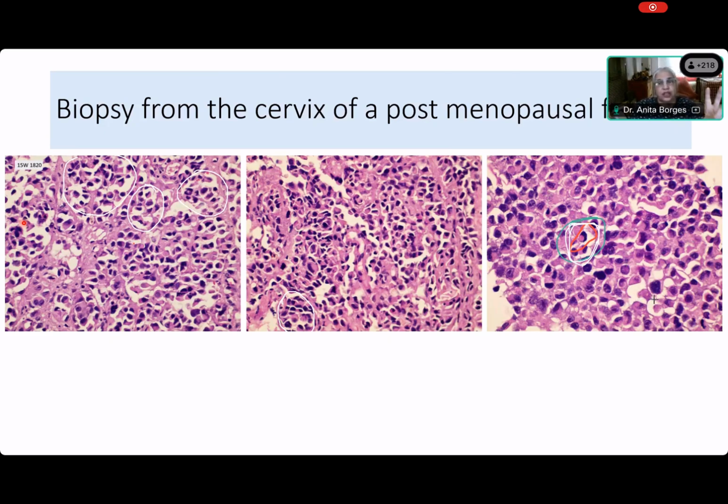The nests suggest to me that this is unlikely to be a sarcoma. Do you agree? You see nests in a sarcoma? Come on, Navneet, you've seen enough pathology. Do you think you get nests in a sarcoma? No. So when you see nests, what does it tell you? Epithelioid region. Very good. This looks like a category of tumors that have an epithelioid appearance. That is something very evident from this.